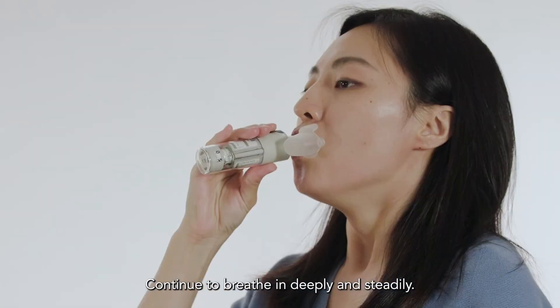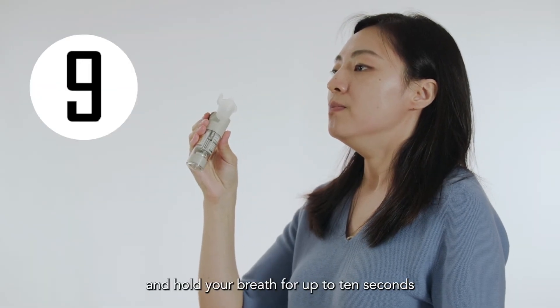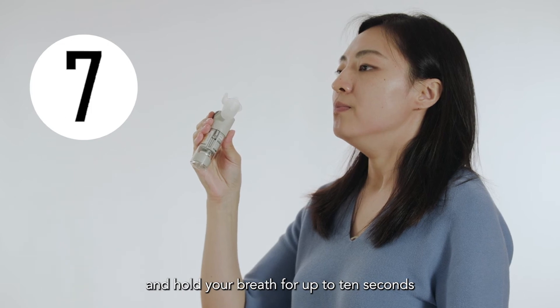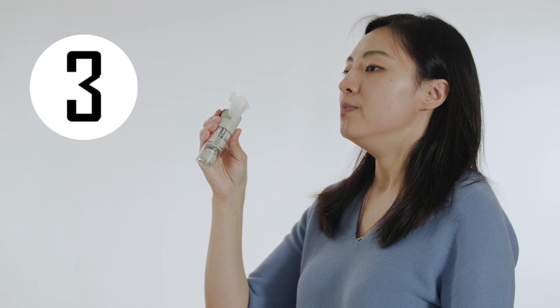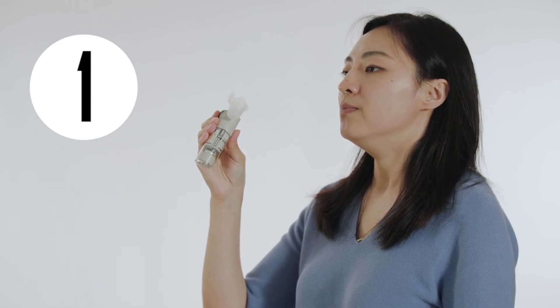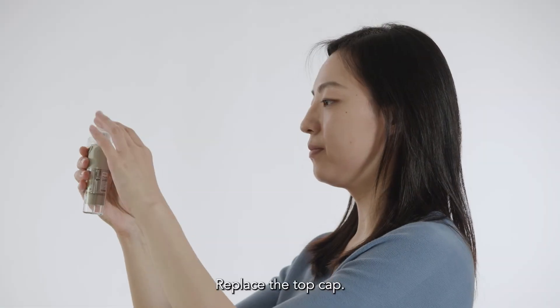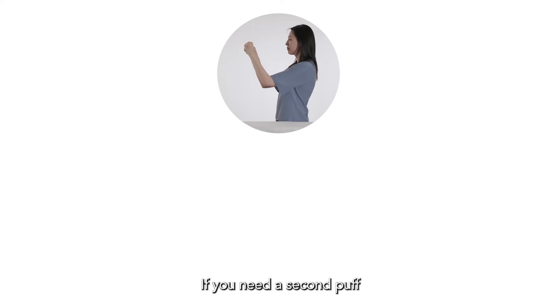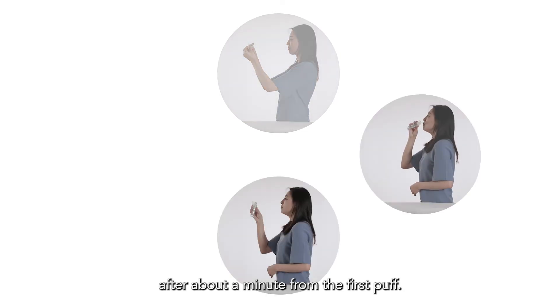Continue to breathe in deeply and steadily. Take out the inhaler from your mouth and hold your breath for up to 10 seconds, or for as long as it's comfortable. Breathe out gently away from the mouthpiece. Replace the top cap. If you need a second puff, repeat these steps after about a minute from the first puff.